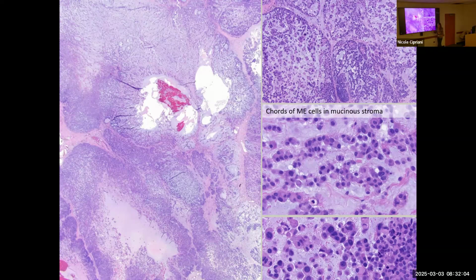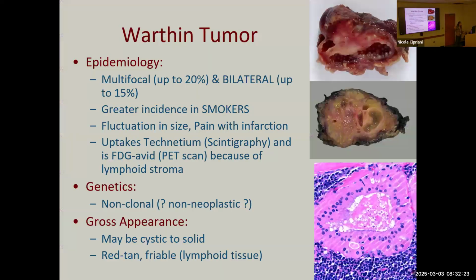As we will see later, but I'm going to say it now, epithelial myoepithelial carcinoma has a very similar low power appearance with these cloud-like globules. The difference is in the cellular components, you'll see both epithelial and myoepithelial cells. And I'll show you that later, don't worry. So that's myoepithelial. Questions?